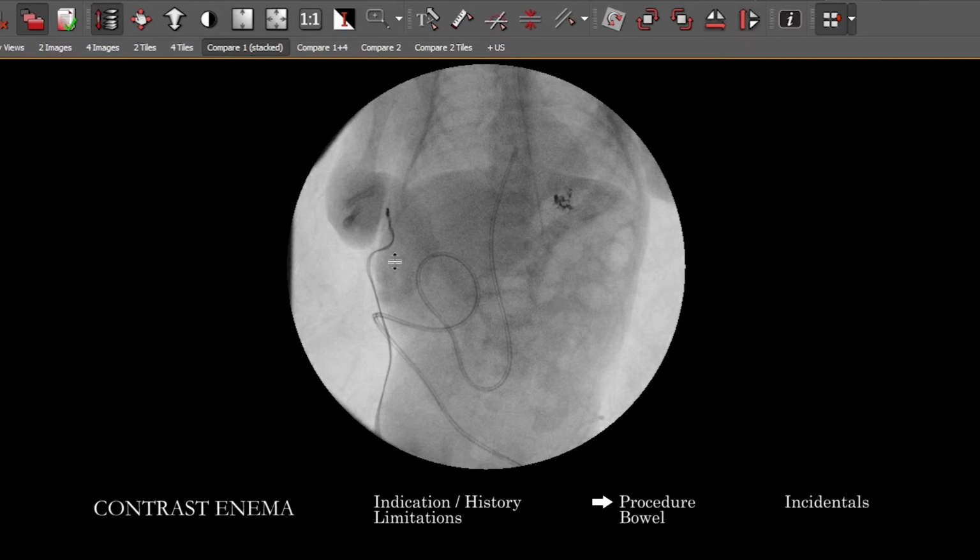As you can see in this particular study, we're already seeing a couple things just on this image. You see the whole anatomy, some of the upper extremities, lower chest, etc. You see that the patient has an umbilical venous catheter. You see an enteric tube projecting with tip near the stomach. We've got some density up here, which if you were to do your homework on this patient, you'd learn is some retained contrast in the stomach. But this is our starting point, just again to look around and see what is going on.